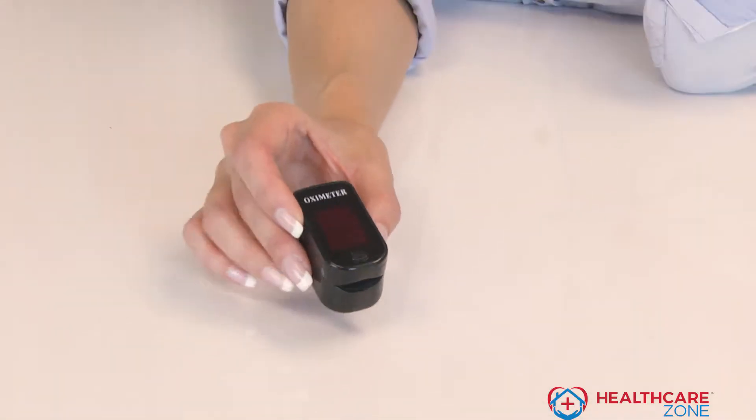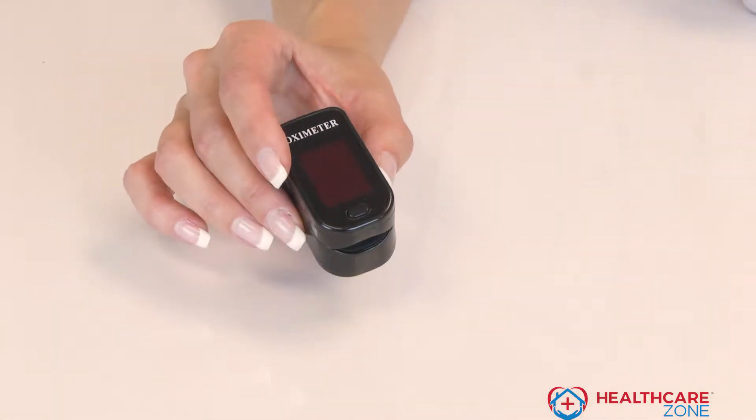Every time you go into the doctor or the hospital, they just pop one of these on your finger, right? This one is made for home use. And since we know how important it is for you to know your pulse rate and your oxygen saturation level, this is something that you can use every day to take care of your health.